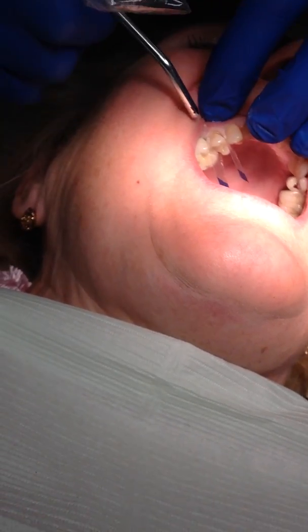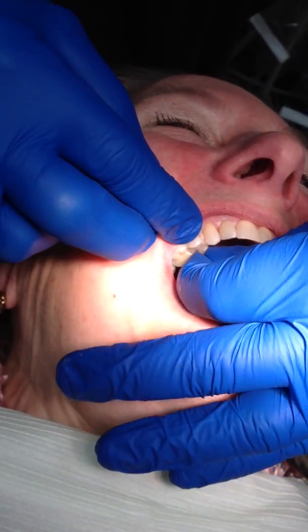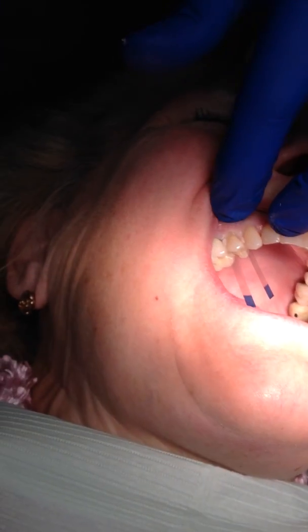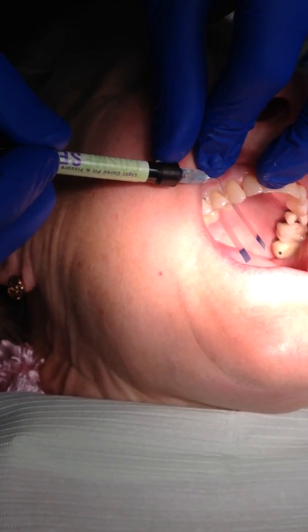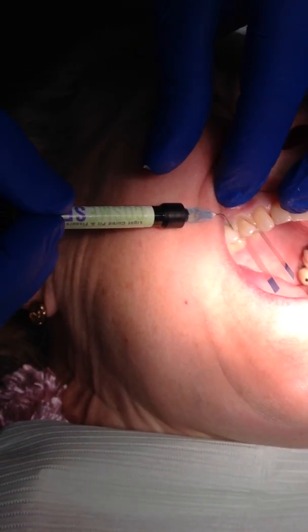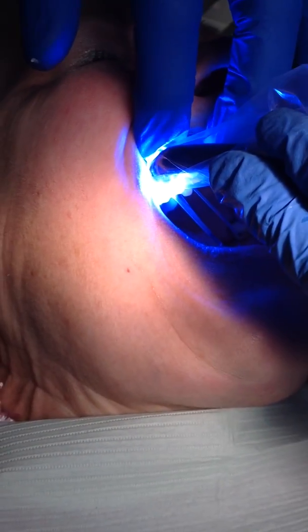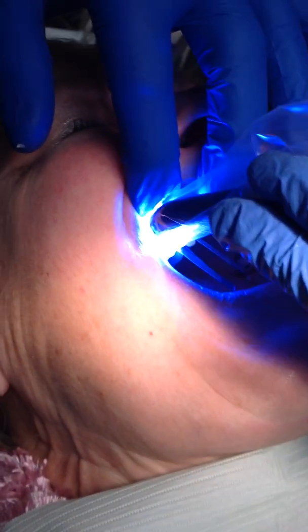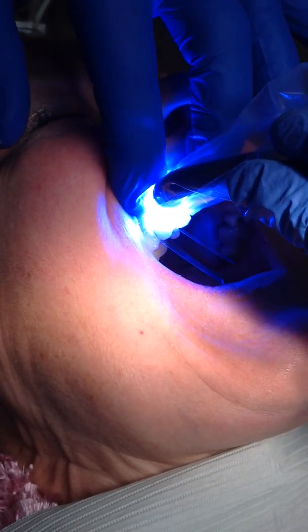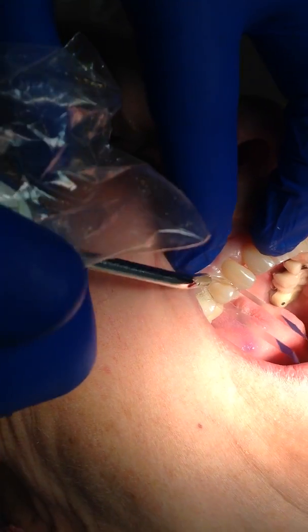Pushing the cotton ball in will hold that very tightly interproximally so we don't have any overhangs. We'll make sure that it's down and tight, blow it off and dry it. We then take some unfilled resin — at the school we'll use a standard flowable, but I tend to use a clear resin because I want to be able to cure through it. We then put that on and light cure it.